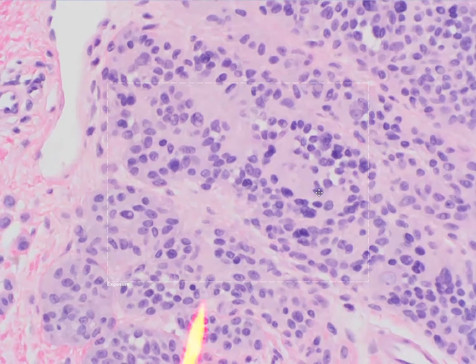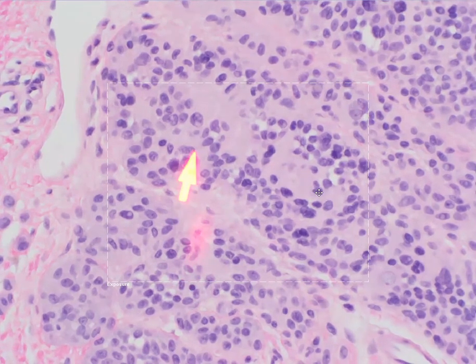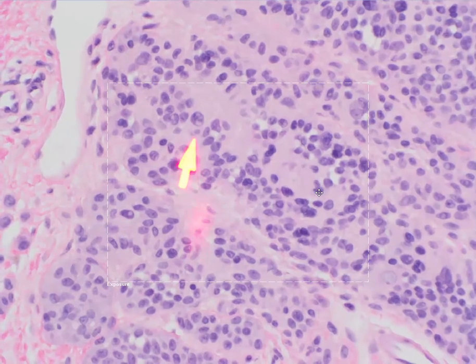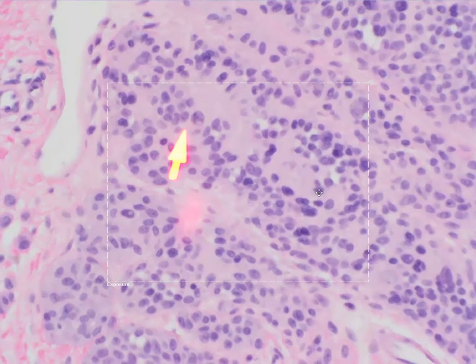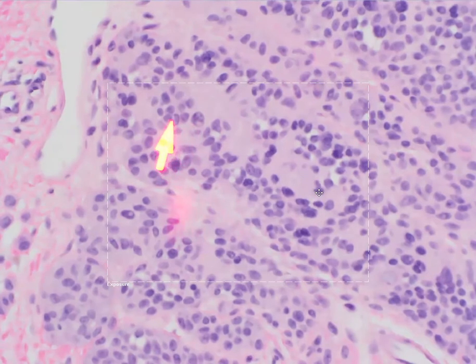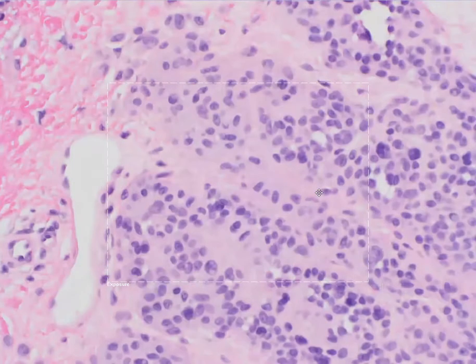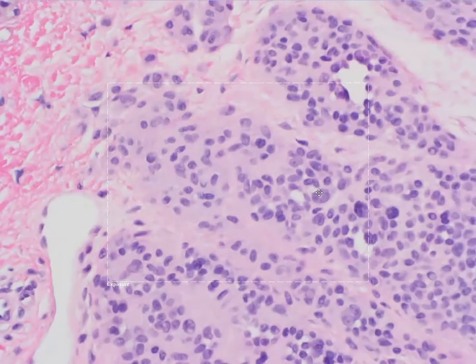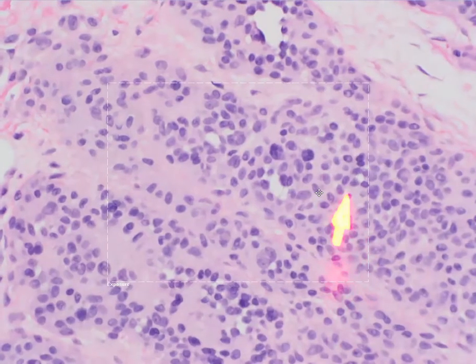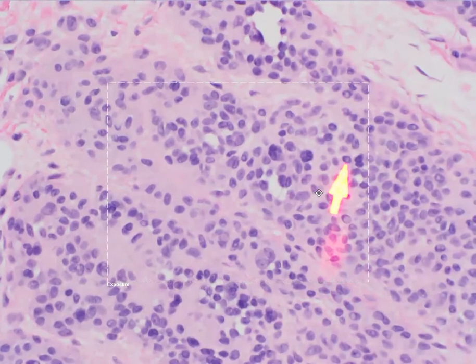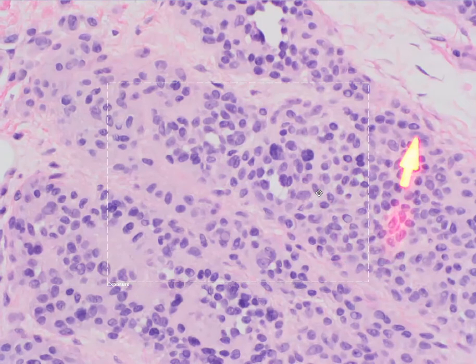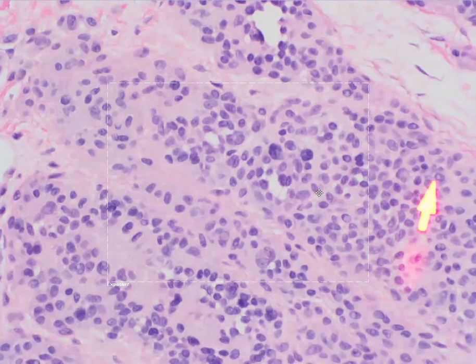Another feature that can help you identify these as nevomelanocytes is recognizing the presence of what we refer to as pseudonuclear inclusions. These are pale vacuole-like structures within the nucleus of the cells, and they are characteristic of nevomelanocytes. So when you encounter a proliferation and you're wondering whether it could be melanocytic, that is a very helpful feature you can use to accurately identify the nevomelanocytes.